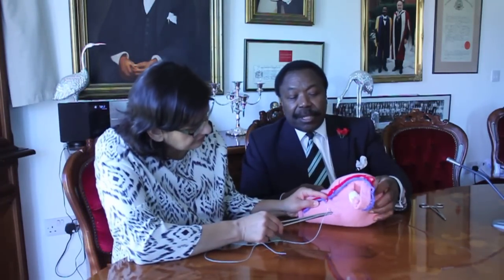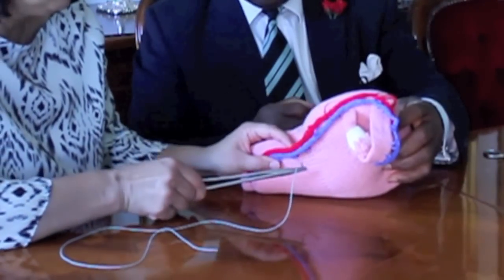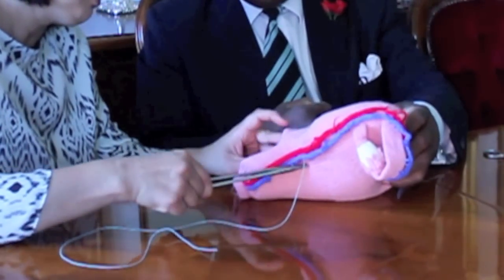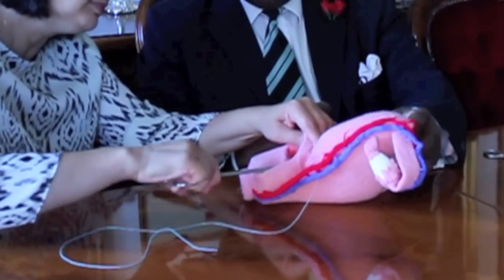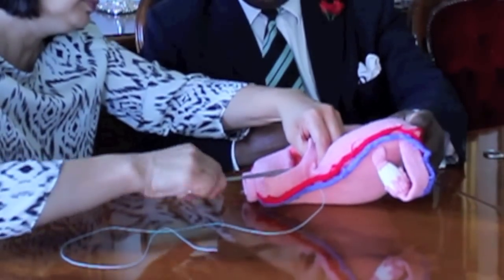You will see the first thing she does is 3 cm above the upper incision margin, posteriorly behind the vascular compartment or the vascular bundle. The needle pierces the uterus and is retrieved in the cavity.